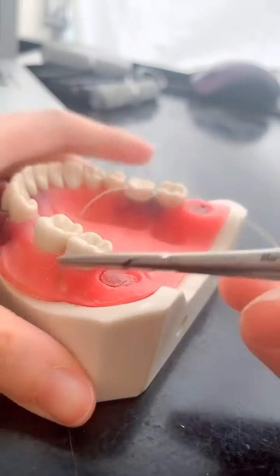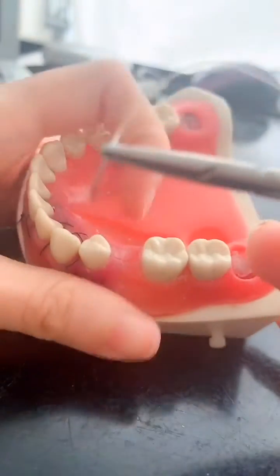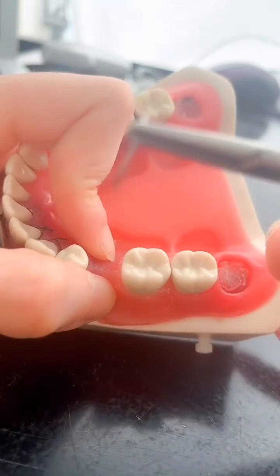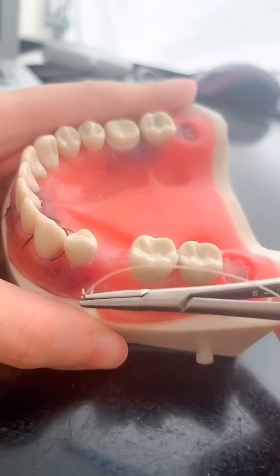So if you want to close with primary closure on a procedure like GTR, this is a very useful suturing technique.